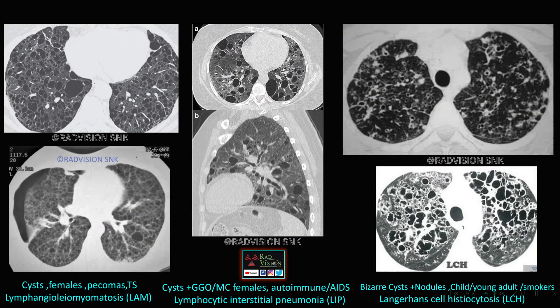Next are three different pathologies presenting with cysts in the lung. Here you can see cysts of varying sizes with thin walls scattered in bilateral lung fields. In another case, cysts of varying sizes are scattered bilaterally with pneumothorax. This was a case of lymphangioleiomyomatosis (LAM), which is common in females — these are benign metastasizing leiomyomatous tumors with a common association with tuberous sclerosis.